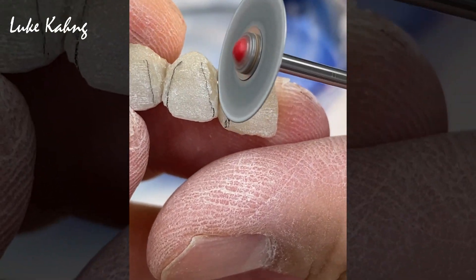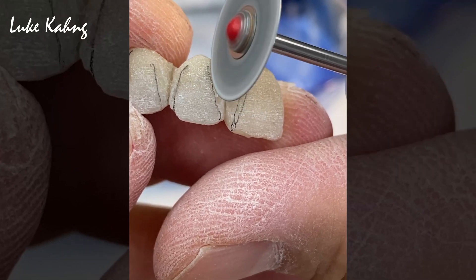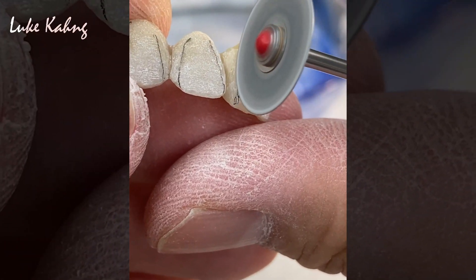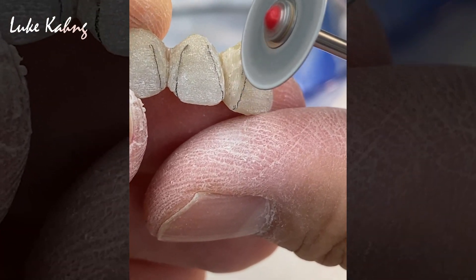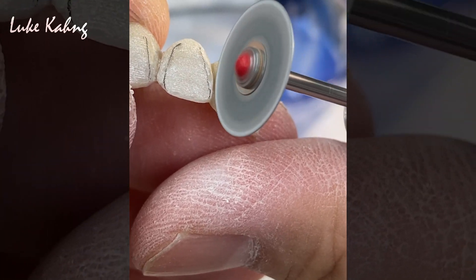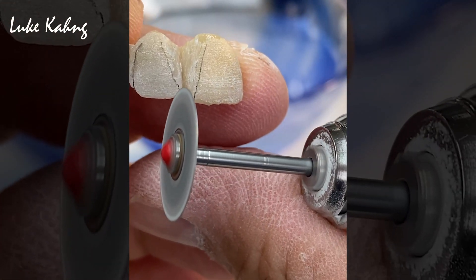Here you see Luke grinding around the edges of the individual tooth, creating a groove in between the teeth. This is so that the teeth look like individual teeth as opposed to a single block in the patient's mouth.